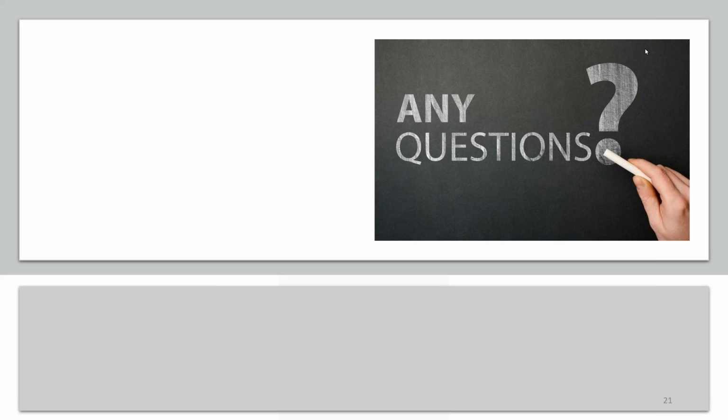So our next question is, Sam, is this biocompatibility study carried out by the manufacturer or by the end user? What is the role of the end user? This question is from Joby. Well, biocompatibility testing is done by the manufacturer. It's not done by the end user. The end user wants to get a product, open it up, take it out of the package and use it.